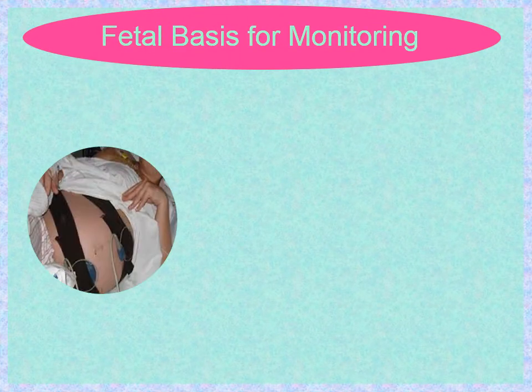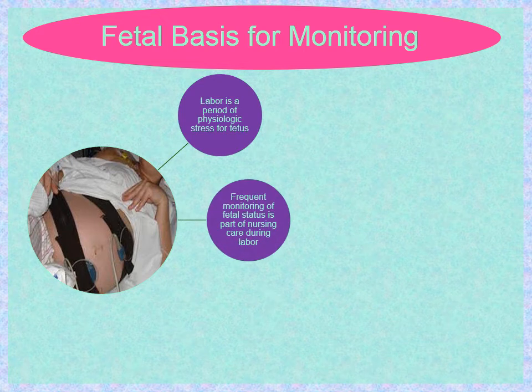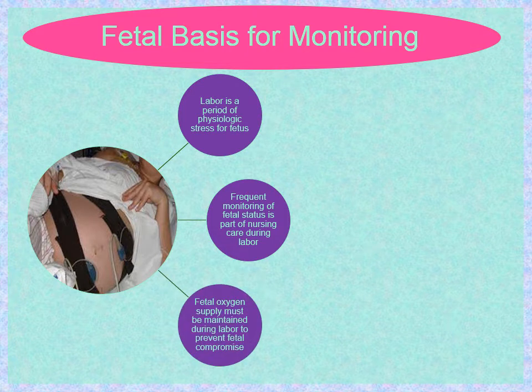The basis of fetal monitoring. Labor is a period of physiologic stress for the fetus. Frequent monitoring of fetal status is part of nursing care during labor. Fetal oxygen supply must be maintained during labor to prevent fetal compromise.